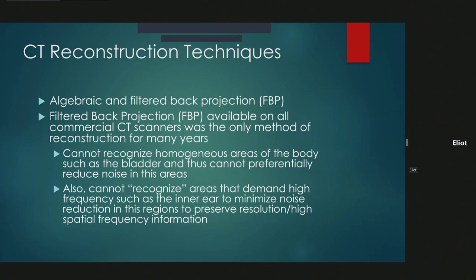One of the challenges with filtered back projection is it's not particularly efficient at being able to reduce noise, and it's very much dependent on dose more than other techniques are. It's not able to, for example, recognize areas of the body that are relatively homogeneous, such as fluid within the bladder, and doesn't really differentially reduce noise in those areas. And so because of that, it has a number of limitations, including also not being able to recognize areas that demand high frequency information, such as the inner ear, to minimize noise reduction.